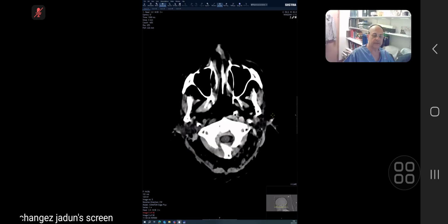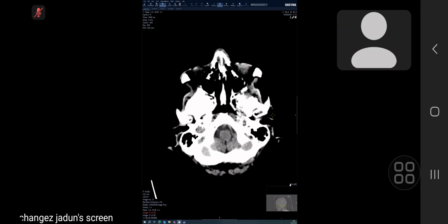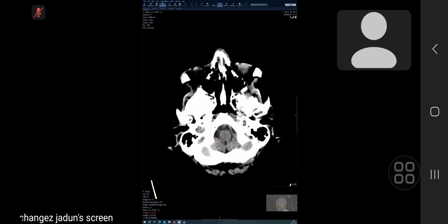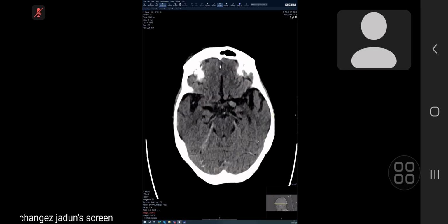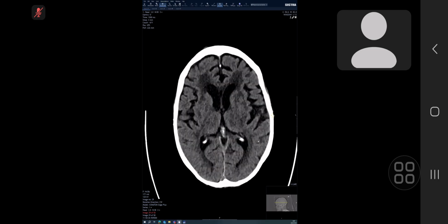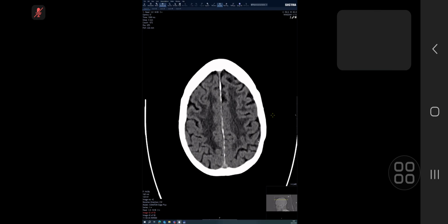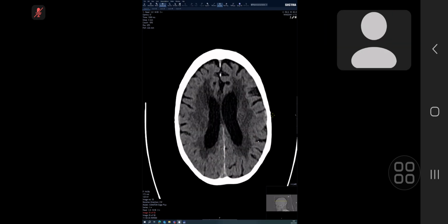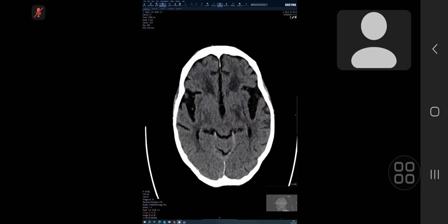Good, you have started to look at the basal sections, foramen magnum. Yeah, in the basal sections, I don't see any significant finding in the brainstem area and in the orbits. But there's definitely pronounced hypodensity in the white matter regions in this patient.